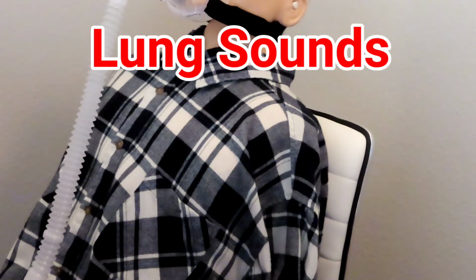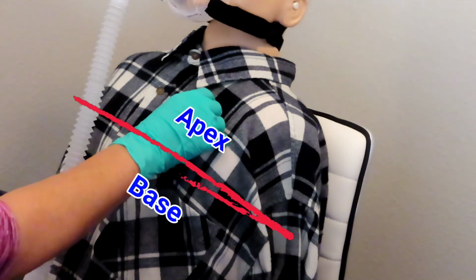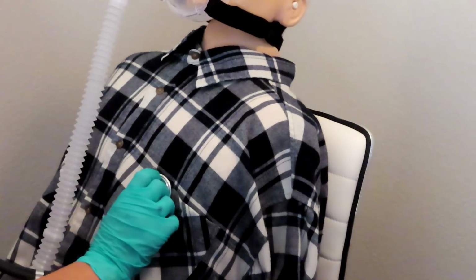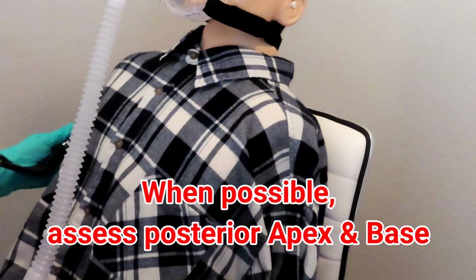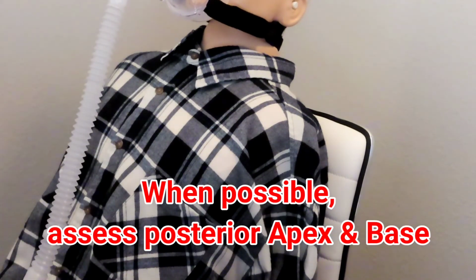This is simply stated. However, if this were a real patient, you would be assessing lung sounds from the upper pectoral region, the lower pectoral region, and mid-axillary line, just lateral to the nipple line. You're going to do that on both sides. If you have access to the back, assess the lung sounds from the back as well.